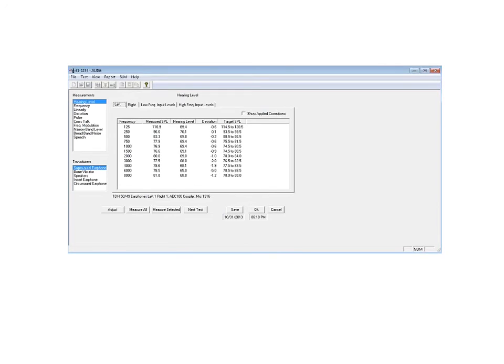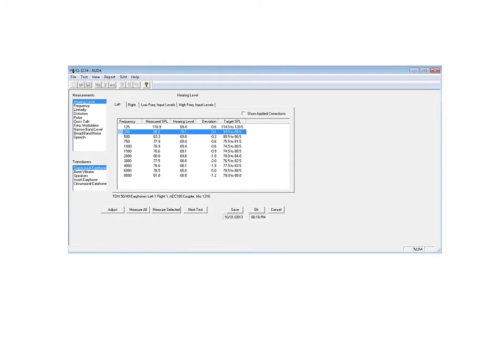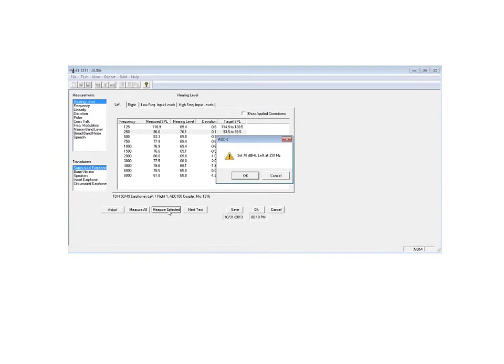As we look at the hearing level, if we use 250 hertz as an example, as we select that, we can measure selected. As we go ahead and hit measure selected, the software prompts us to set up the audiometer now, turn the dial to 70 dB hearing level, and set the frequency at 250 hertz.